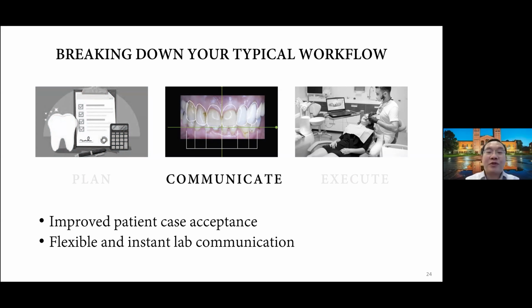If you're going to be a prosthodontist doing denture cases, removable partial denture cases, multiple teeth, full mouth rehabilitations, those are going to come in handy too. If you can show them a full mouth mock-up of how their teeth are going to be beforehand, or even send them an email, that would really increase their case acceptance, right?